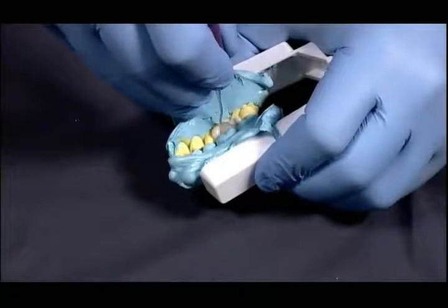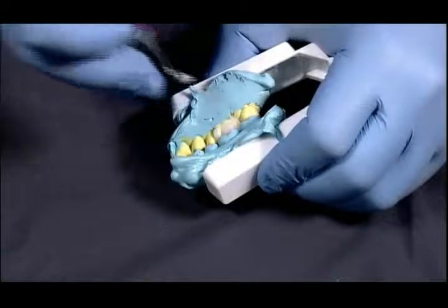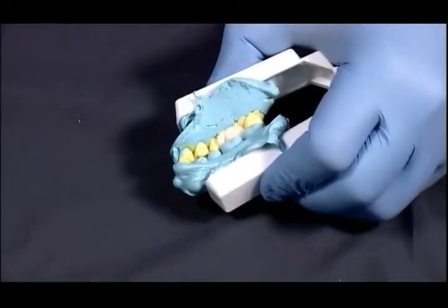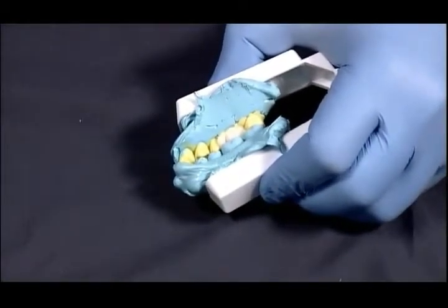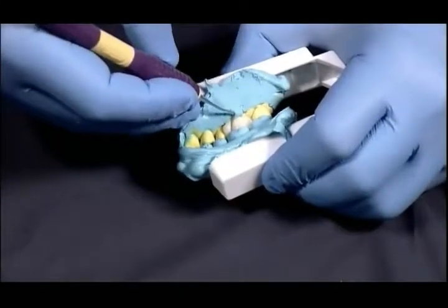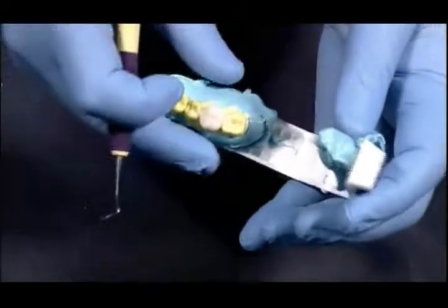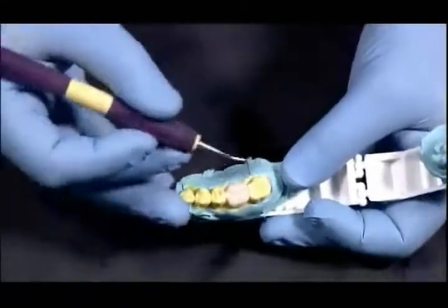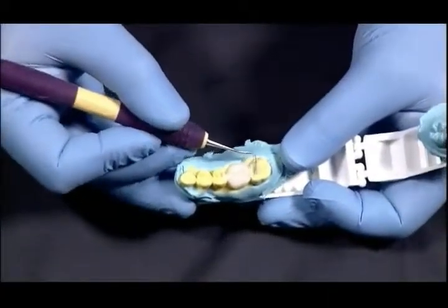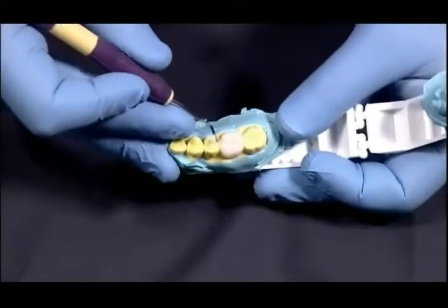The curing aspect of this is crucial. I want to make sure that you're testing your lights in your office so that you have a very strong curing light, whether it's halogen or LED, I don't care, as long as it's a very strong output that you have with the light. I'm going to be utilizing a curing light today that has extremely strong outputs. There are many of them on the market. I just happen to be using this particular one.